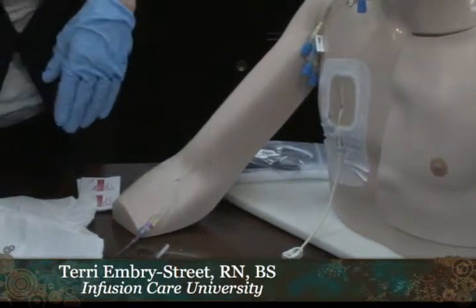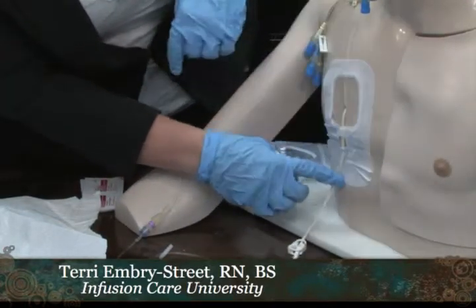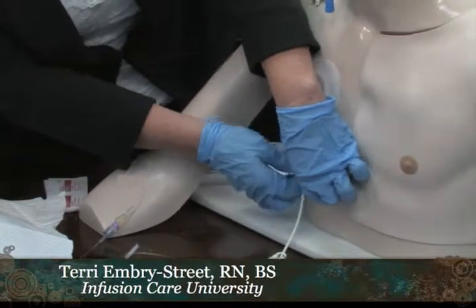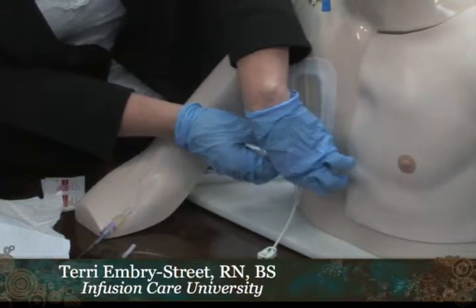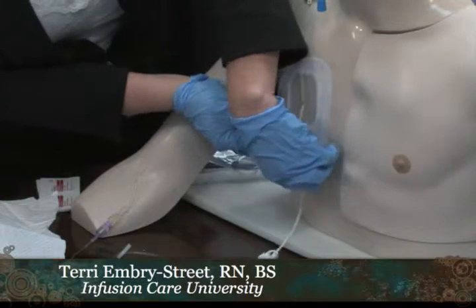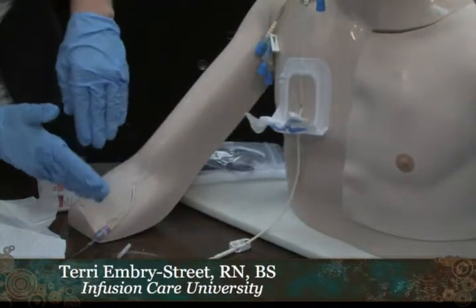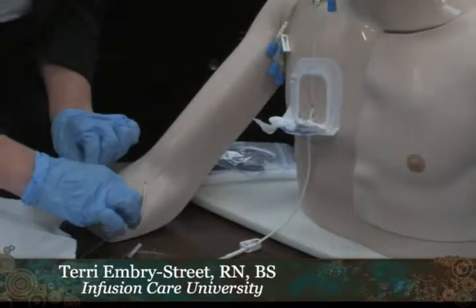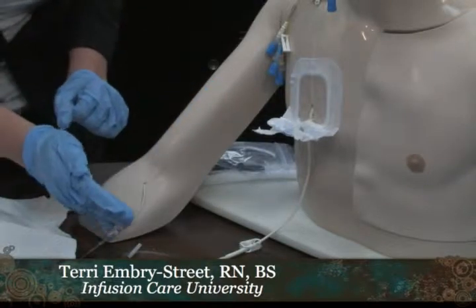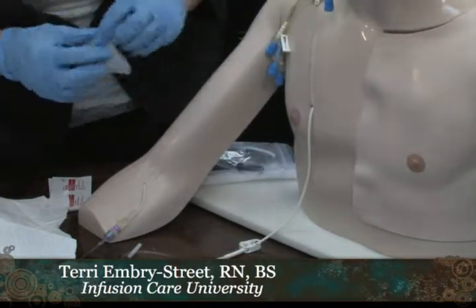When you go to remove the SorbaView, there is a video available from the manufacturer that gives a great view of this. You look for the little notches and tear them. You want to roll the SorbaView up toward the patient. On a PICC line, you always tear the notch and roll it up toward the patient — you never want to remove a PICC line dressing by pulling outward, for fear of dislodging or pulling out the PICC. It literally just rolls up, and that's how you remove it.